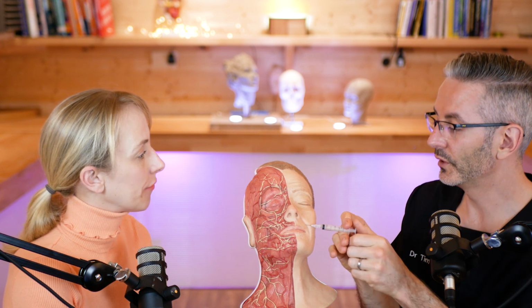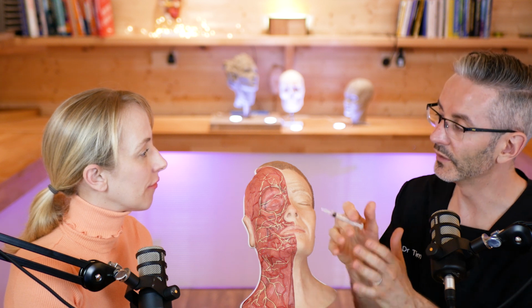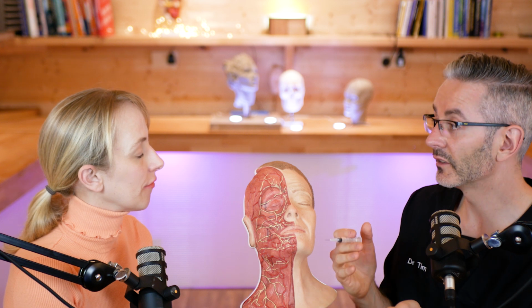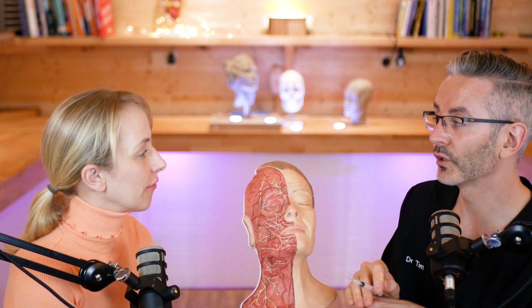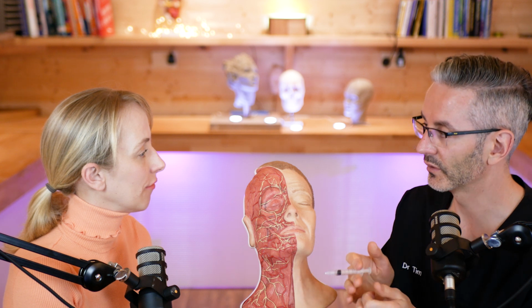Yeah, when people first try this, if they're not doing it in a way that's neutral, they move the needle tip around. That means the needle tip is stabbing into different areas. So this is why, if you haven't got a good aspiration technique, the argument that it causes more trauma is probably true, which is why you need to understand aspiration technique first, which is all around the stability and the neutral vector across the syringe. That will give you control.